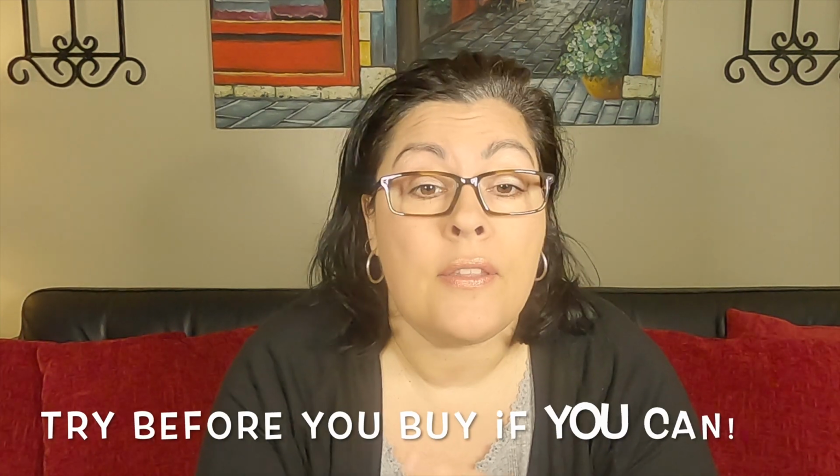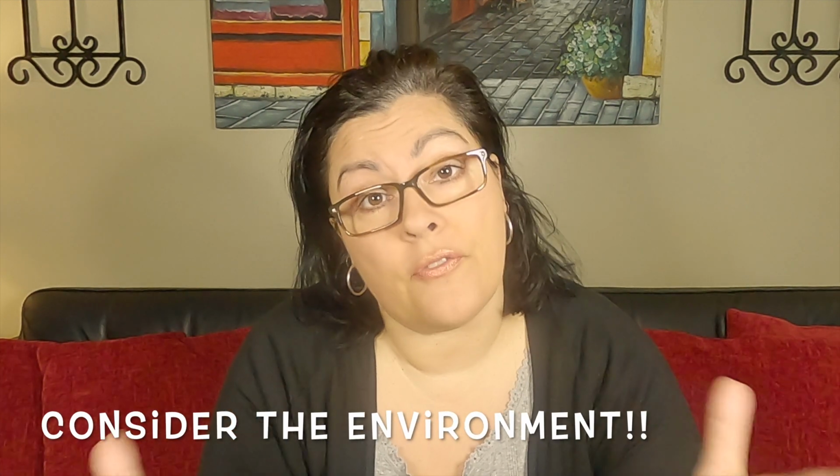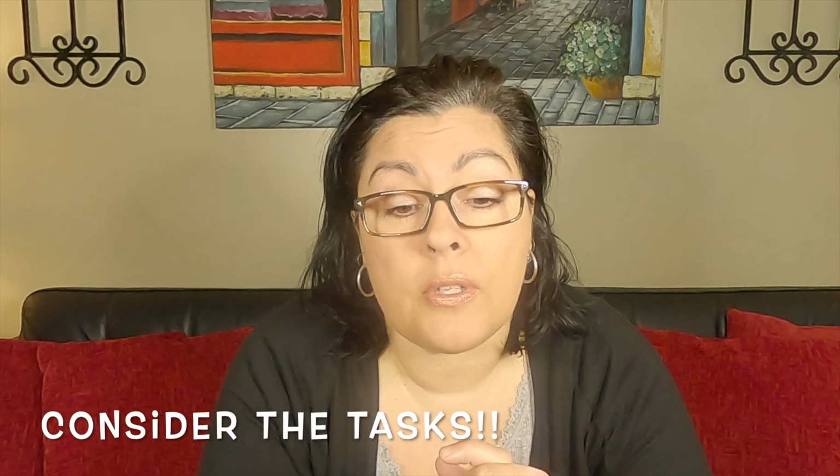So what's the takeaway? The takeaway is always try before you buy. You can't just look at a video or read the specs online. Everybody's vision is unique, and you really need to not only look at the product, but also the environment. What is the task? How's it going to be used? So in the instance that happened to me, he said, I'm a hunter and a pecker. I'm not a fast touch typist. I just need to see the keys occasionally. And this is the one that I can see the best.